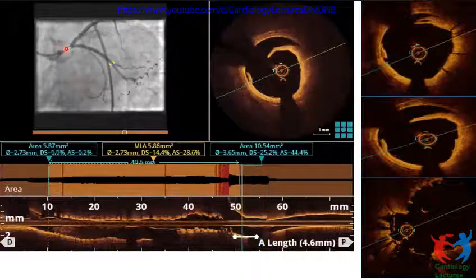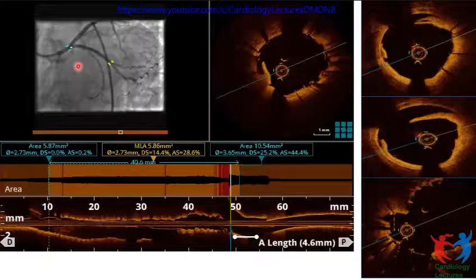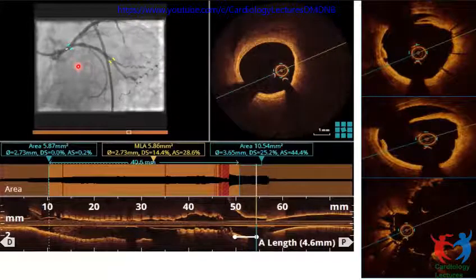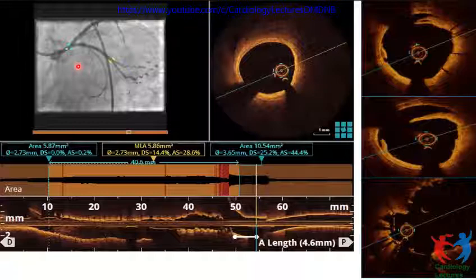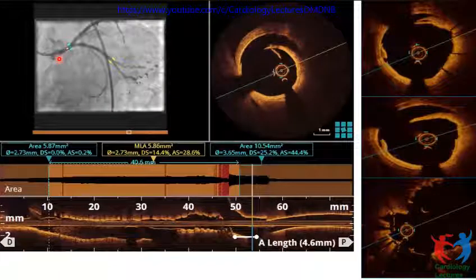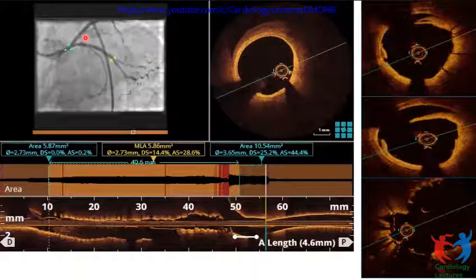This is the same example that Dr. Matthew sir was saying in Natarajan sir's case. When he was treating the proximal LAD, probably some dissection like this from the left main would have closed that vessel. And that was the reason for that sudden collapse of the patient. This is also a similar thing, but documented with imaging. Angiographically, we couldn't make it out. We thought, is it thrombus or something, why is this LCX occluding. But it was a very clear dissection, as rightly Matthew sir pointed out, something from there as a dissection has extended.